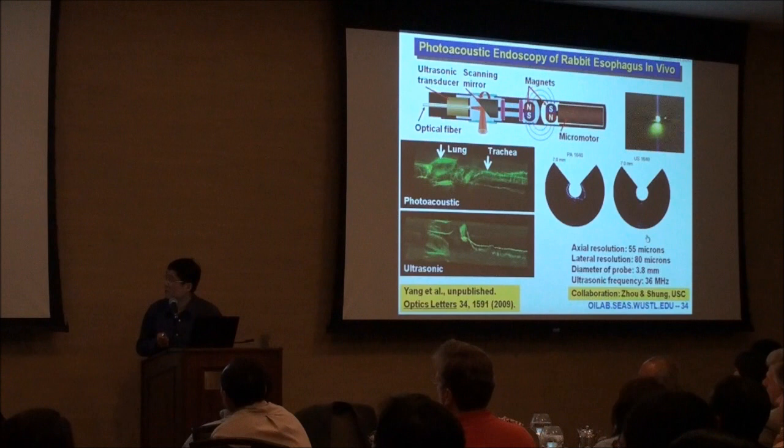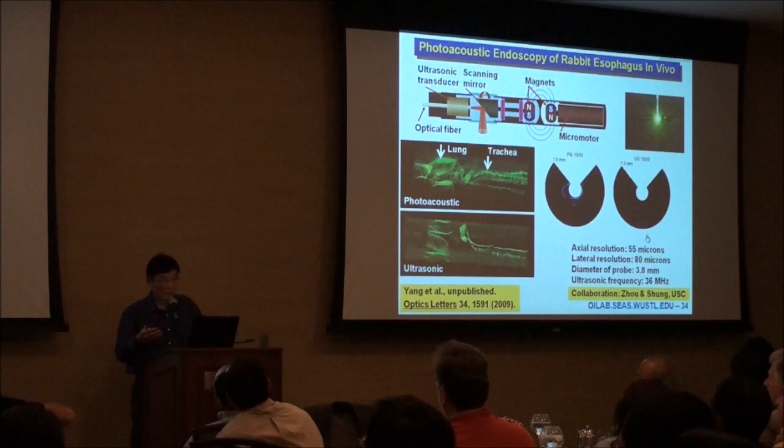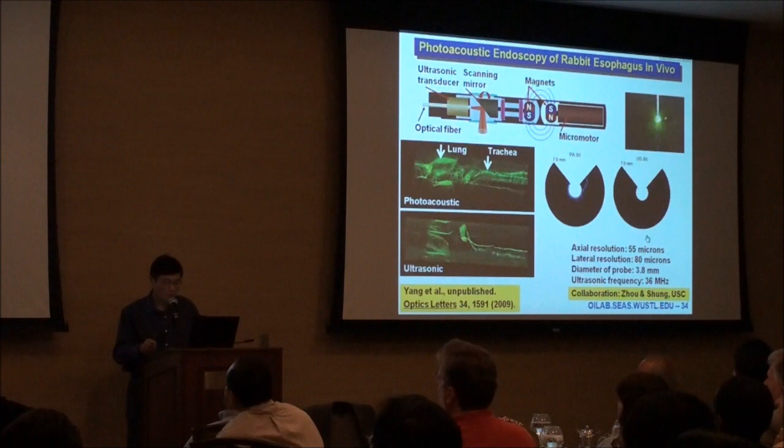In standard optical endoscopy, we get a limited penetration of about a millimeter. And a lot of lesions can be beyond that depth. So physicians want to have a deeper penetration capability. They prescribed about 3 millimeters or so. Our device can penetrate about 7 millimeters in the current version.